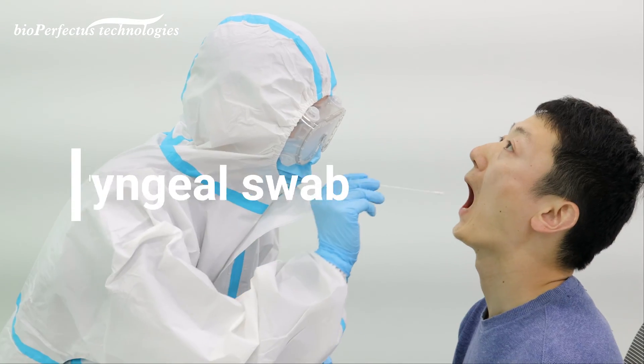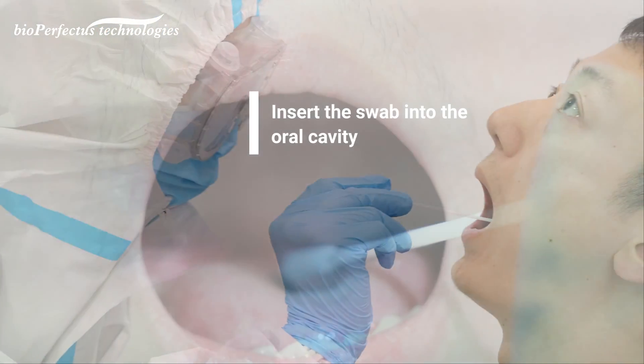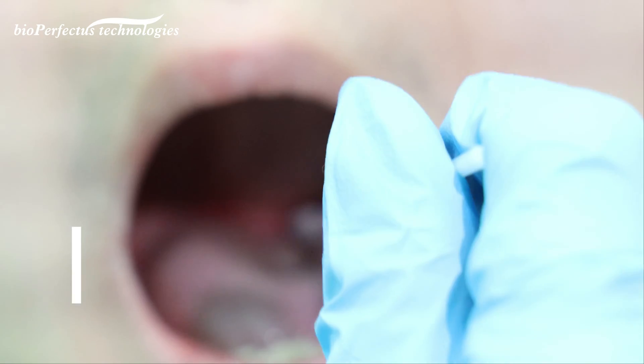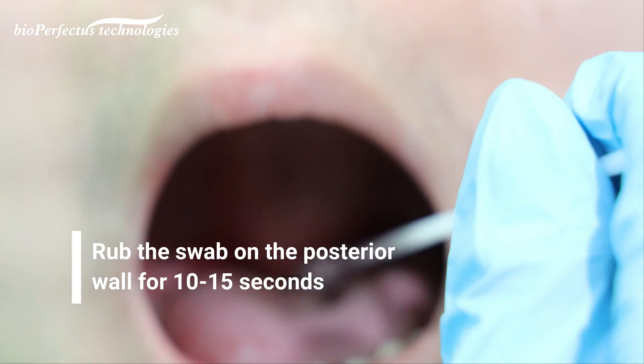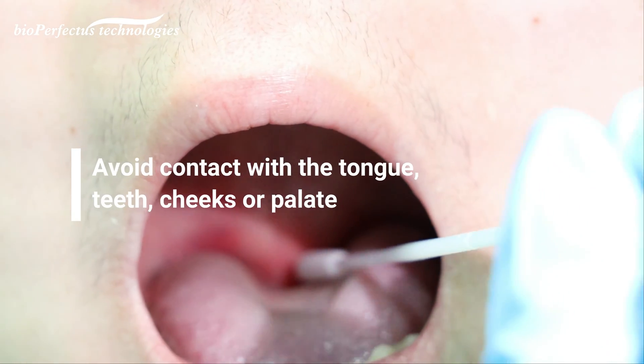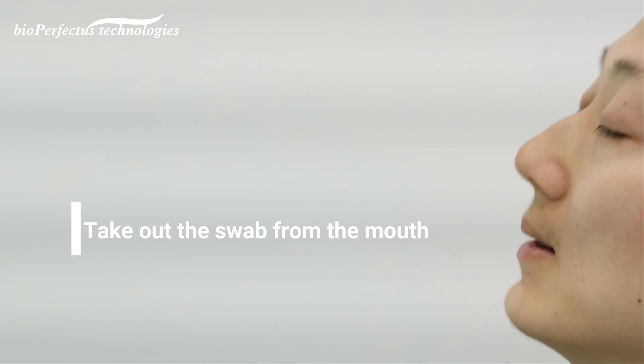Pharyngeal swab: Insert the swab into the oral cavity. Rub the swab on the posterior wall for 10 to 15 seconds. Avoid contact with the tongue, teeth, cheeks, or palate. Take out the swab from the mouth.